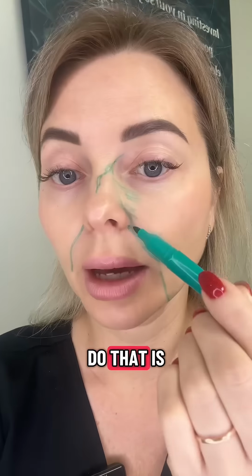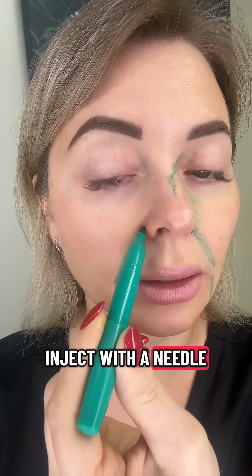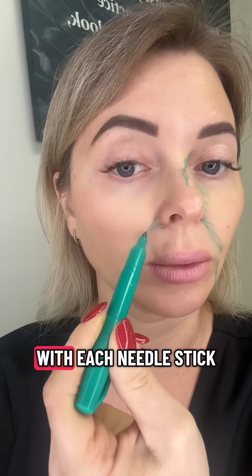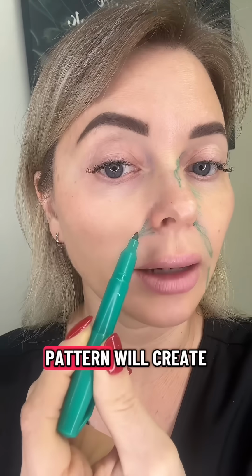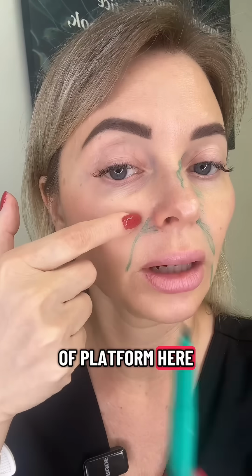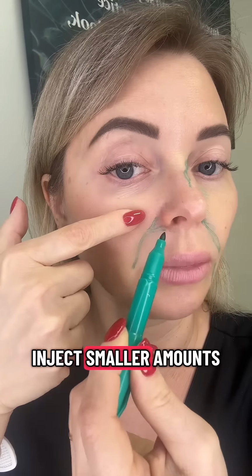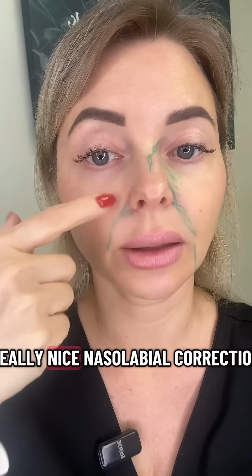To avoid this complication is to inject very minimally right at this area right here. And the way that you can do that is you can actually inject with a needle, with a little bit of a fanning pattern here, of course aspirating with each needle stick. But the fanning pattern will create a little bit of a platform here as opposed to a big glob of filler, and this will allow you to inject smaller amounts and still have really nice nasolabial correction.